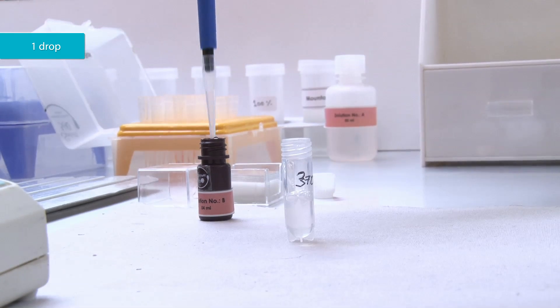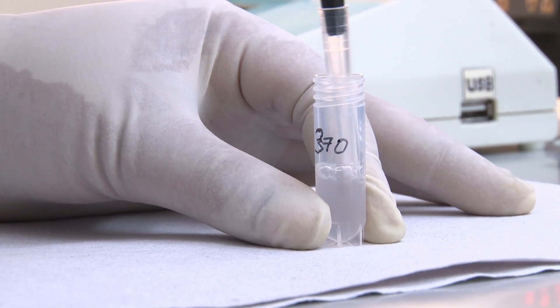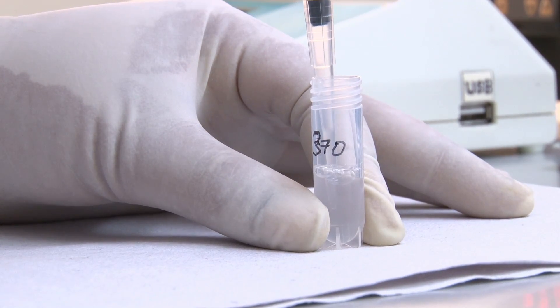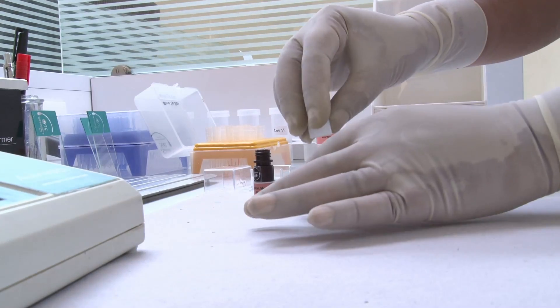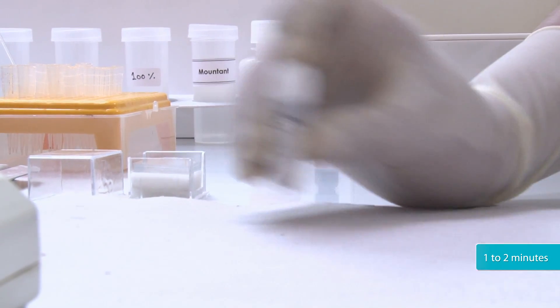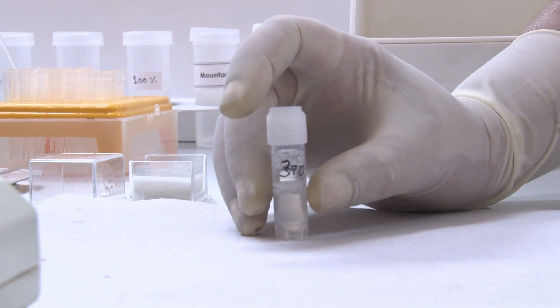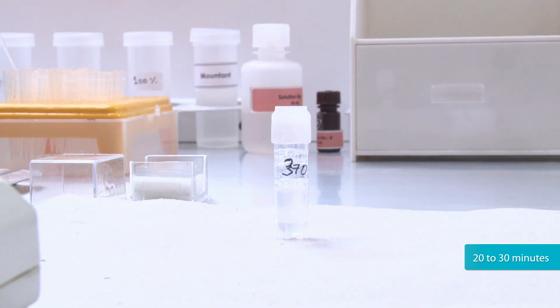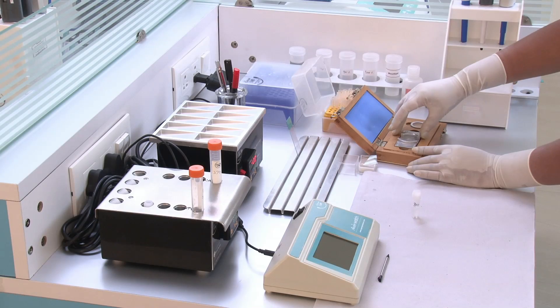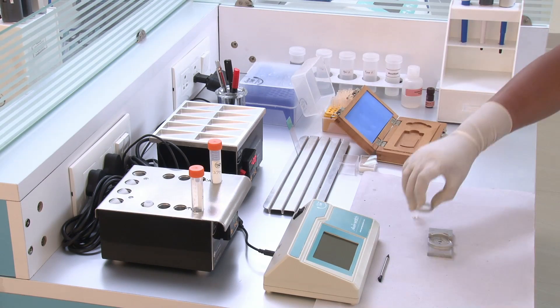Add a drop of solution B in the microtube and mix it well. Shake the microtube for 1-2 minutes. Keep the microtube at room temperature for 20-30 minutes. Use a sperm meter or glass slide to examine the results.